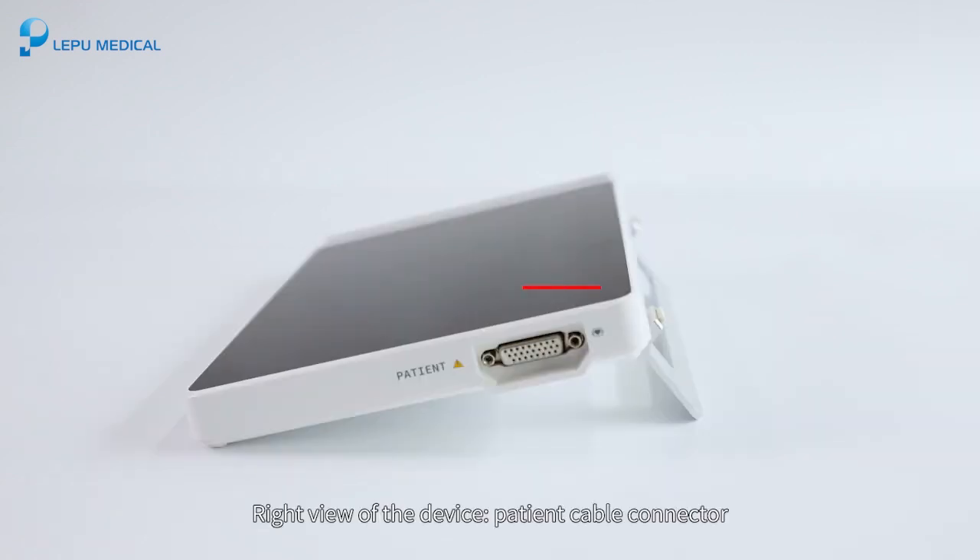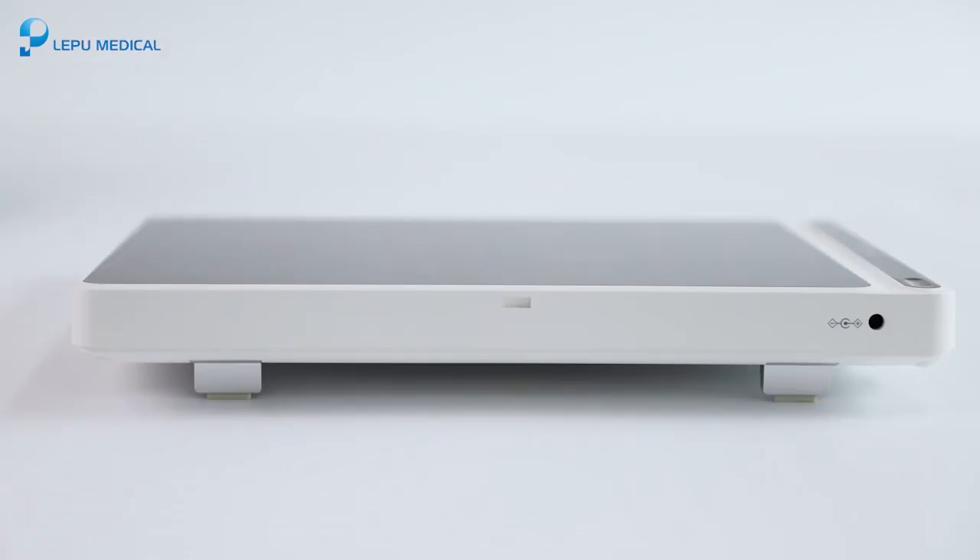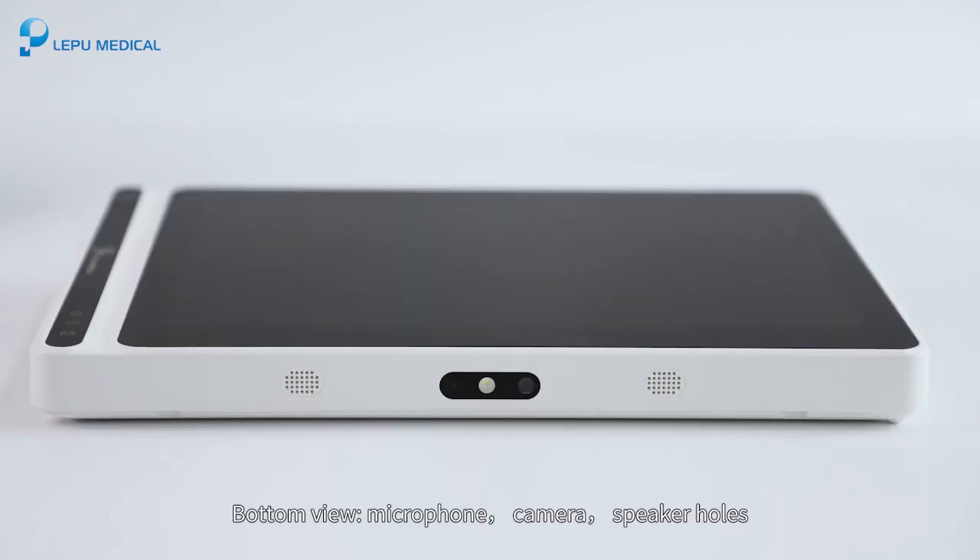The right view of the device shows the patient cable connector. The rear view includes the recorder base connector, handle, battery compartment cover lock, and battery compartment. The top view shows the DC power connector. The bottom view features the microphone, camera, and speaker holes.